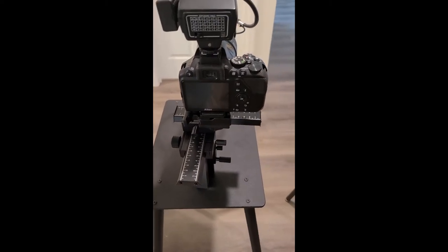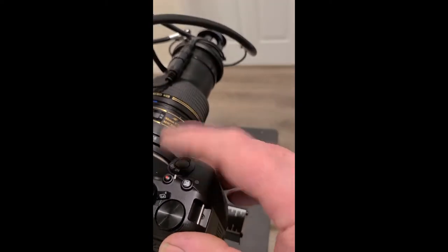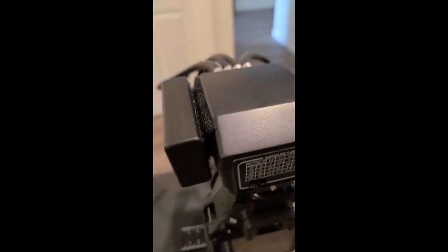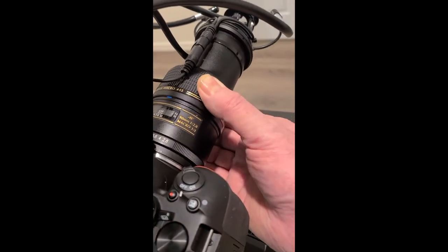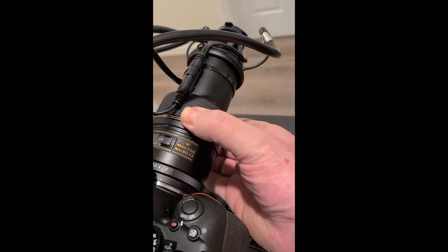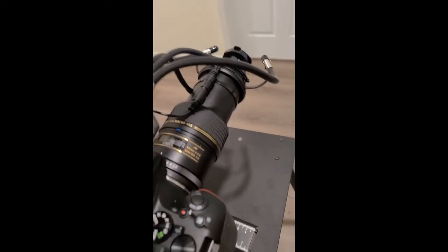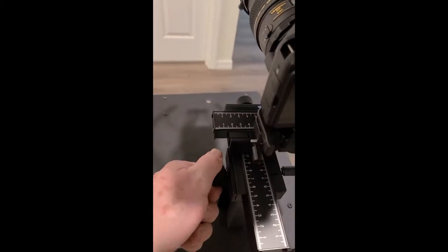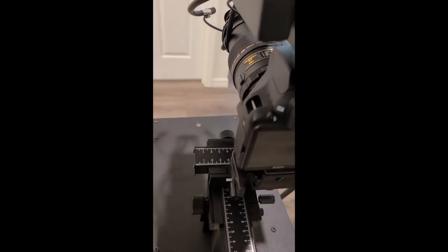To recap the things to keep in mind: there's an on/off button here, an on/off button here, and an on/off button here. Also, make sure you can move the collar so it moves the lens, and that the lens stays all the way out. You leave the lens all the way out and do your focusing with this macro rail knob — it moves the camera closer and further from the eye, and that's how you do your focusing.